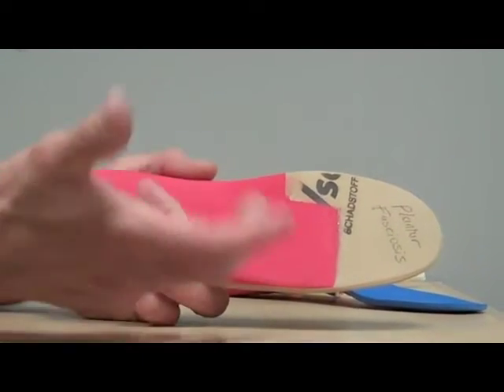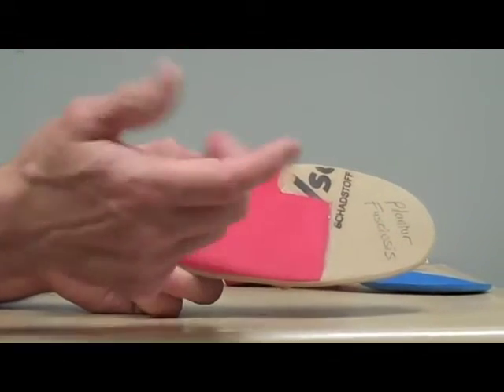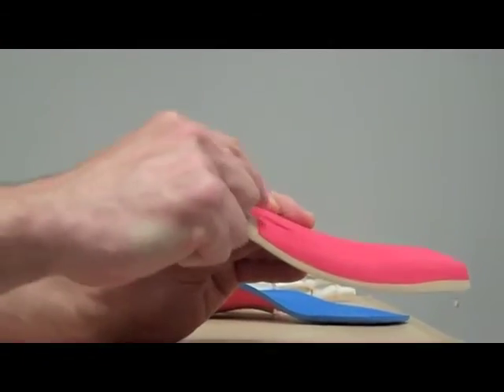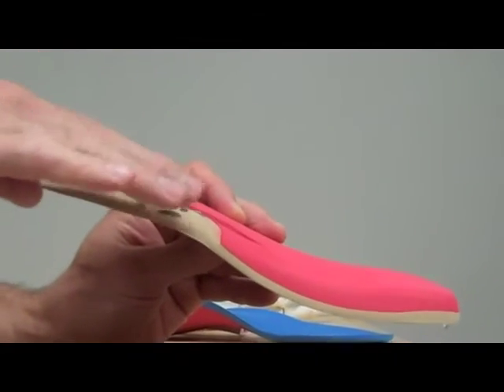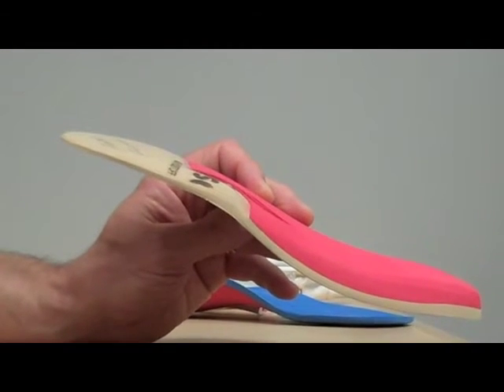So some people have an issue with their first metatarsal joint, degeneration or a spur or whatever, it just hurts. So what I do is I keep this a little bit thicker. You see that? A little bit thicker here relative to there. So I'm still keeping that big toe lower than the second toe, but I'm just not doing as much of that valgus post that I did with the other one.